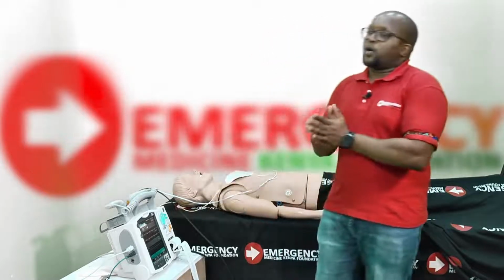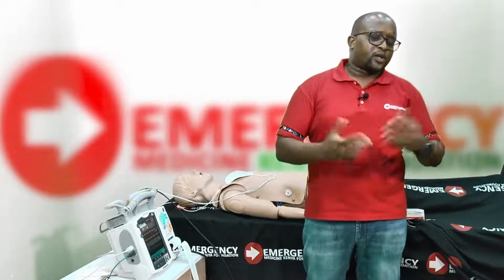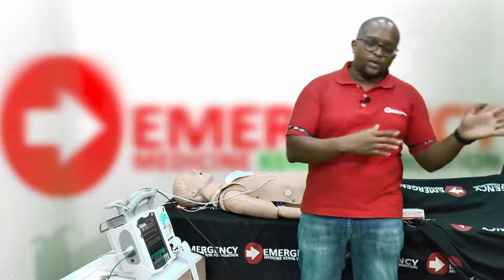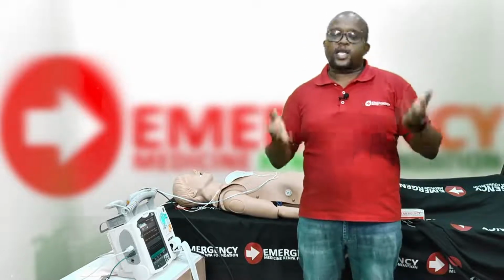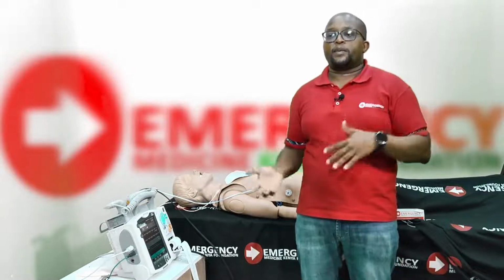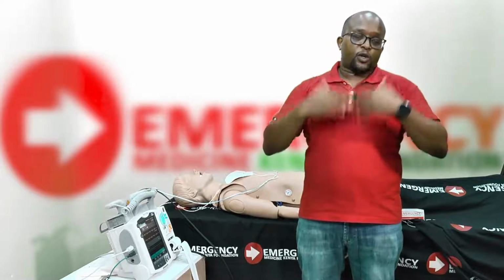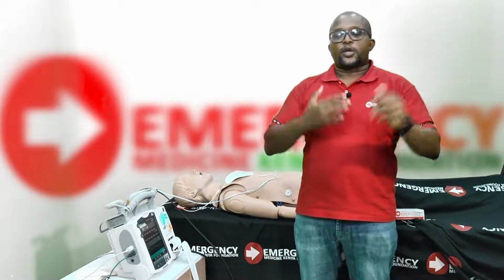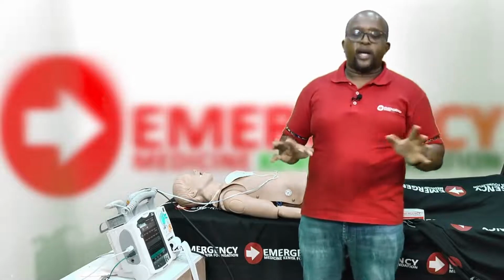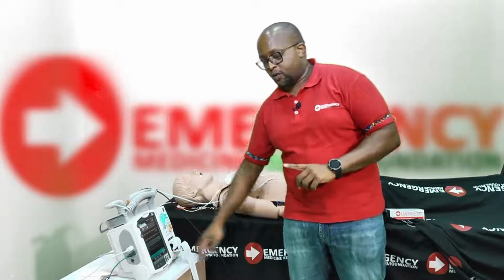All right. Now, in what setting do you want to be on demand mode? In a patient who's admitted maybe in a critical care unit or coronary care unit where they're just resting on the bed, there's no one moving them around, it's a good idea to have them on demand mode, in which case the machine can go into a standby mode when the patient's heart rate has gone above what you set. Okay, so in a stable setting where the patient is not going anywhere. But if you were to move this patient anywhere at any point, you must make sure you're on fixed mode.